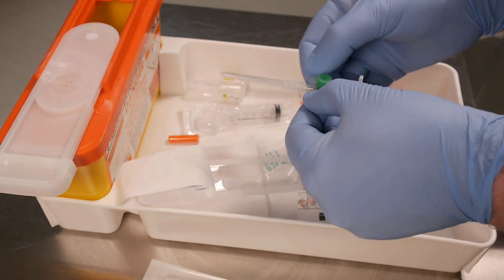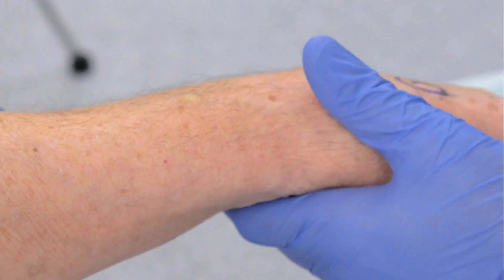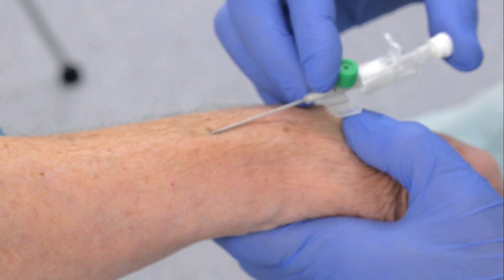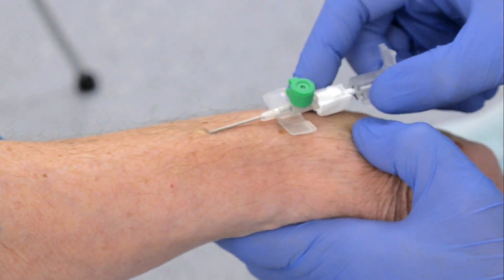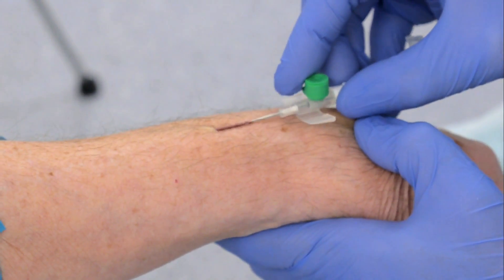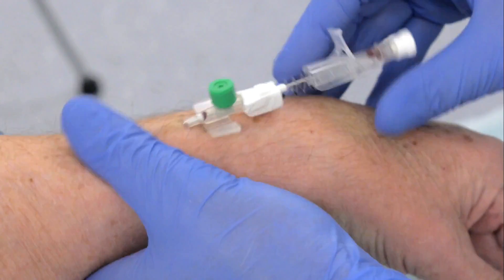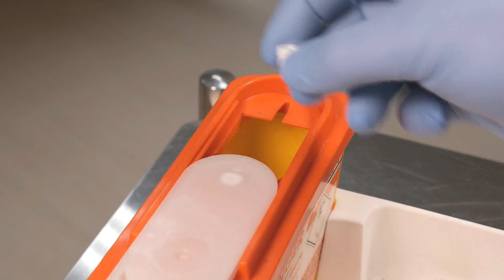Prepare the cannula and inspect the device carefully. Hold it in your dominant hand. Align the needle with the vein and apply manual traction to the skin. When entering the vein, a flashback will be seen. Withdraw the needle and a second flashback means you can advance the cannula into the vein. Gently apply pressure above the vein, remove the needle and dispose of it carefully into the sharps box.